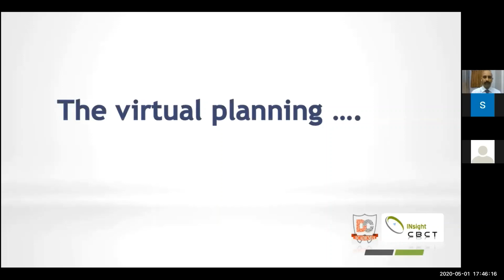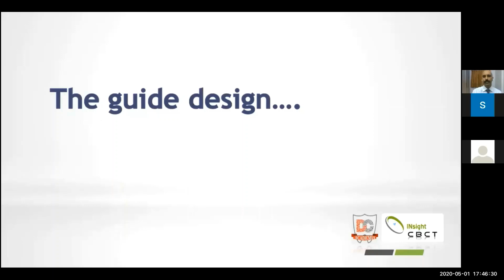Once the virtual planning is done as per the requirements of the implantologist, like Dr. Swapnil mentioned, the software generates this report, and that is then sent across to the clinician. Once the approval is done, the guide design is also performed. Dr. Swapnil did this so efficiently and so fast, but in the actual process it takes much longer because he uses a lot of fundamentals and principles in incorporating the guide design. There are a lot of principles involved. We're not going into the theoretical aspect today, but we have just shown you a brief design that could be generated from the software. That's how it appears.